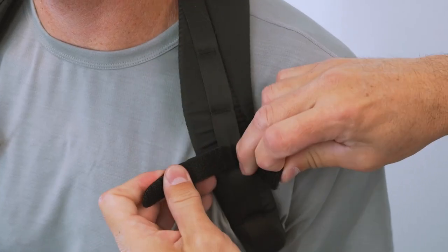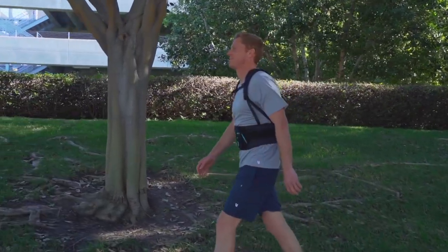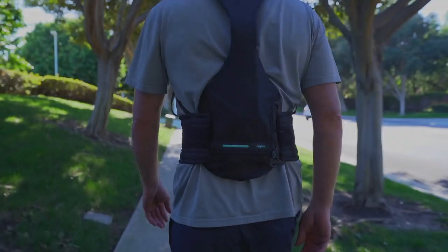The chest straps are easily removed if they are not used. The Horizon Pro should stay in position and remain fixed with patient movement. Clinicians should always determine proper adjustment and wear time.